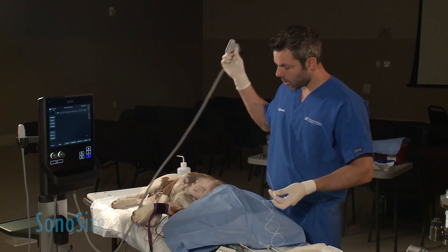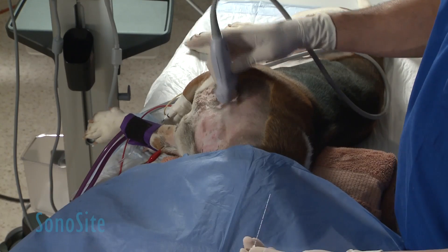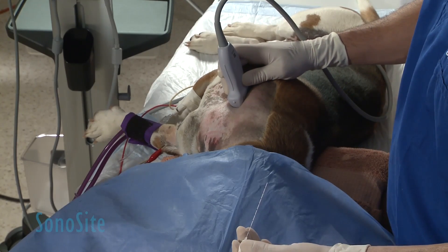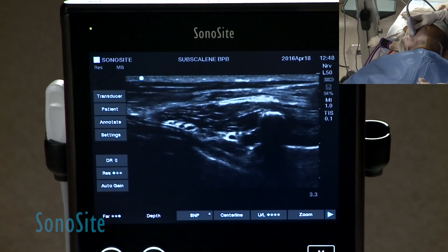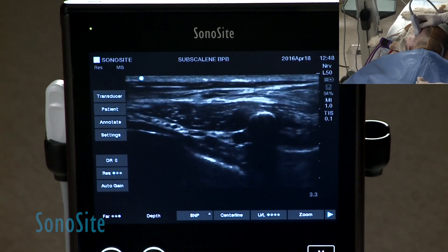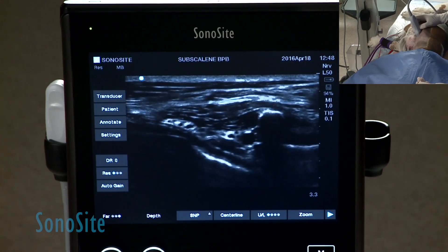When we look at these structures here, we can scout this image. Put the probe just on top of my first rib. From the most ventral portion, I find the rings of the trachea. I can keep moving up until I find the rib and basically the roots of the brachial plexus, just coming out under the scalene muscle.